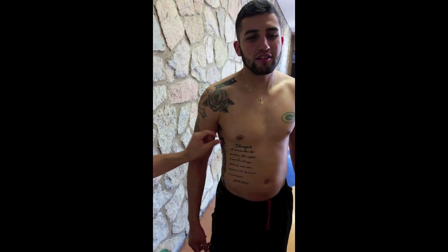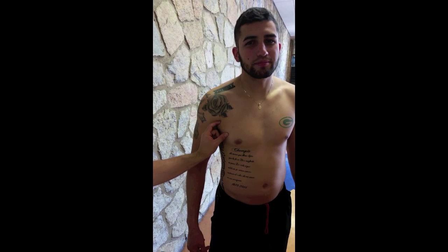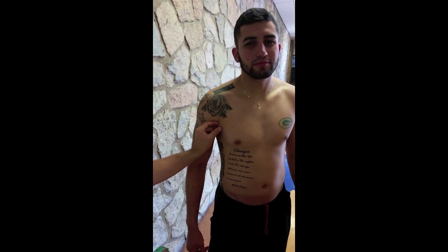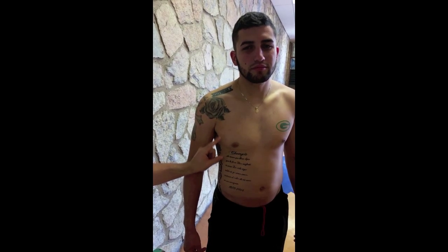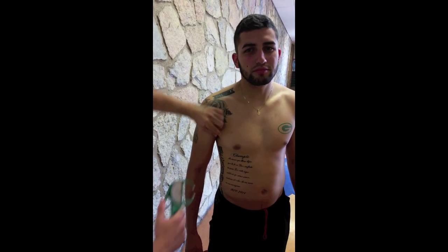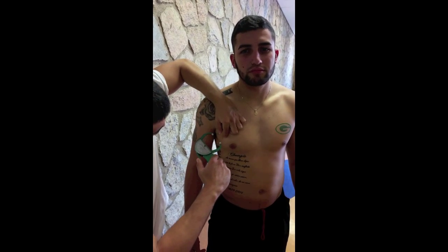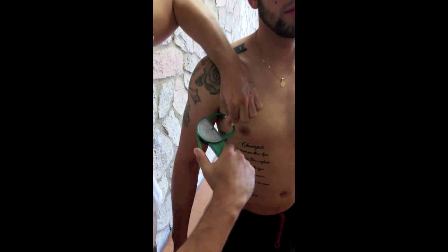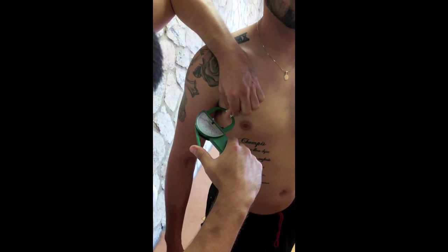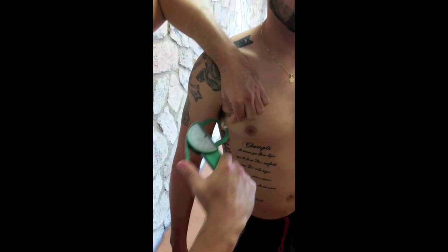For the chest or pectoral site, you will begin with a diagonal fold. There are 2 different measurement sites between men and women. For men, you will measure 1/2 the distance between the anterior axillary line and the nipple. As for women, you will measure 1/3 of the distance between the anterior axillary line and the nipple.